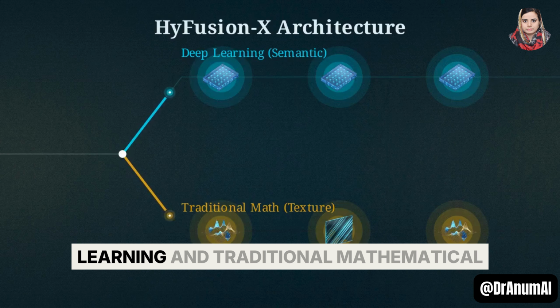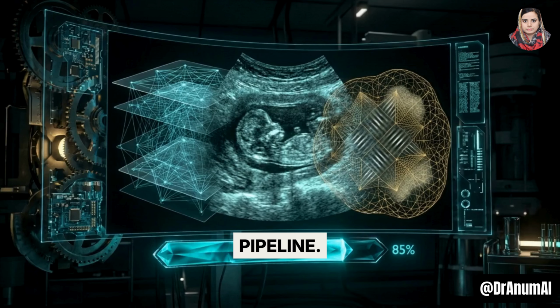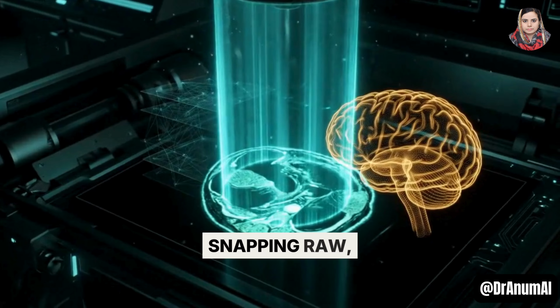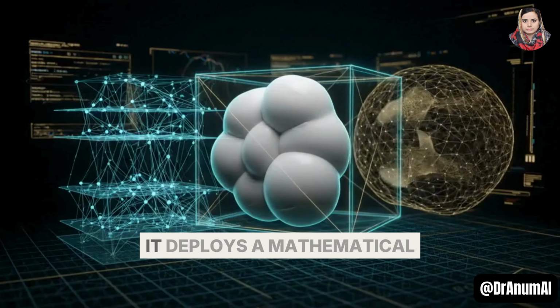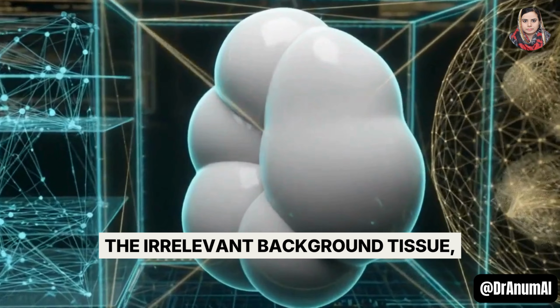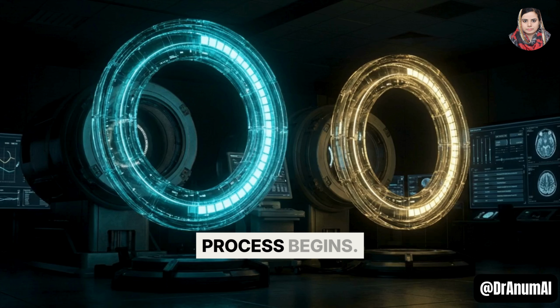It runs both deep learning and traditional mathematical extraction methodologies simultaneously. The process begins with a robust pre-processing pipeline. The framework applies contrast enhancement techniques known as CLAHE and Haar wavelet transforms, snapping raw, low-contrast medical scans into sharp, noise-free clarity. Next, it deploys a mathematical segmentation technique called Otsu's multi-thresholding. This cuts away the irrelevant background tissue, perfectly isolating the exact region of interest containing the suspected mass. Now, the parallel dual extraction process begins.